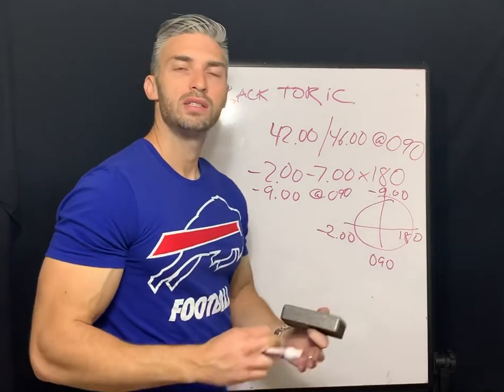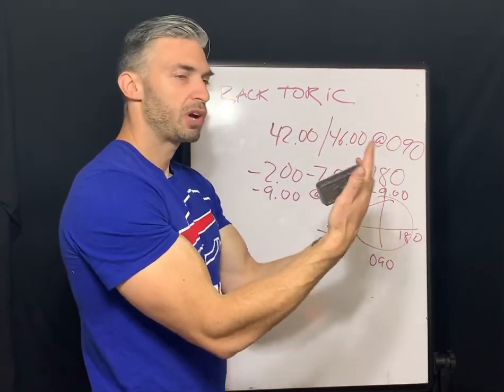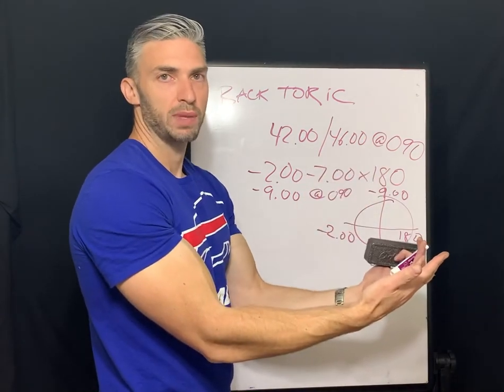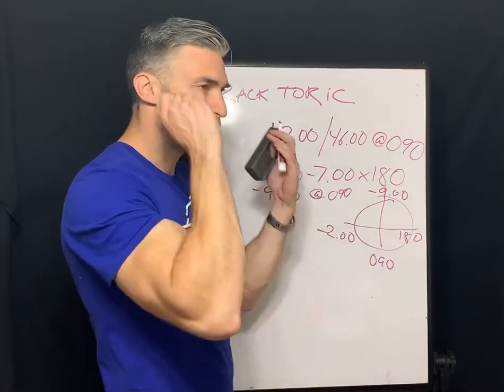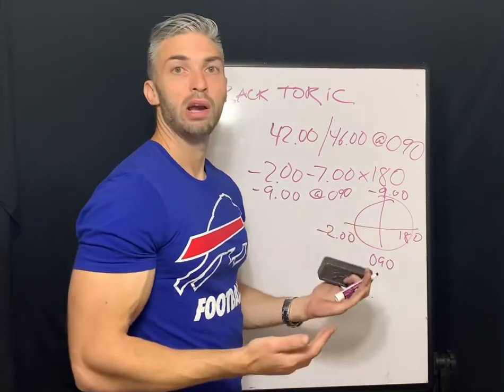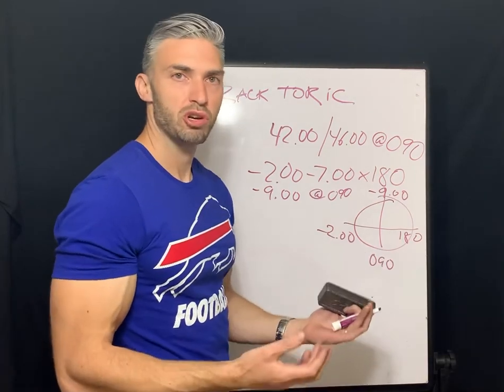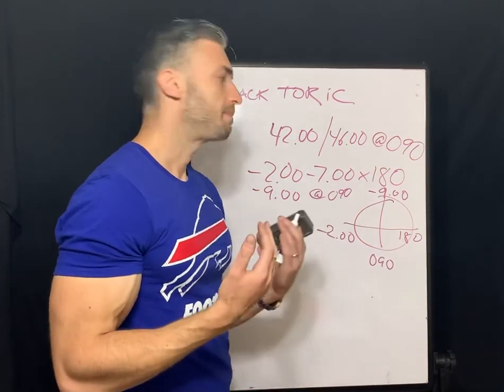Well, all lenses that are refracted, again, let's pretend they're out here. They're acting more plus the further away they are from the eye. Kind of like people put their glasses down on their nose to increase magnification. It's a good way to remember it. But so contact lenses, we're always making the contact lens prescription more plus or less minus.